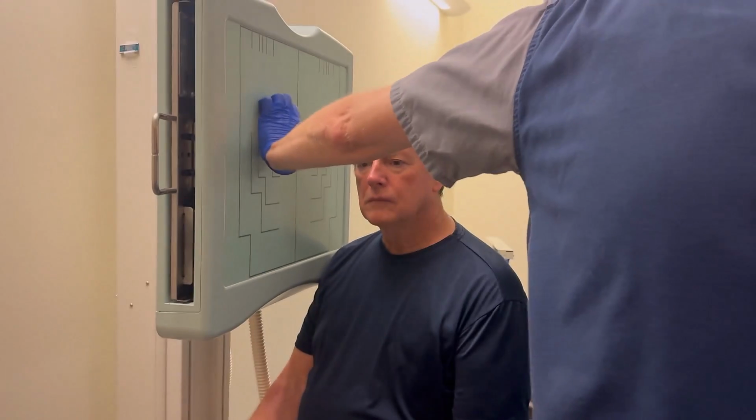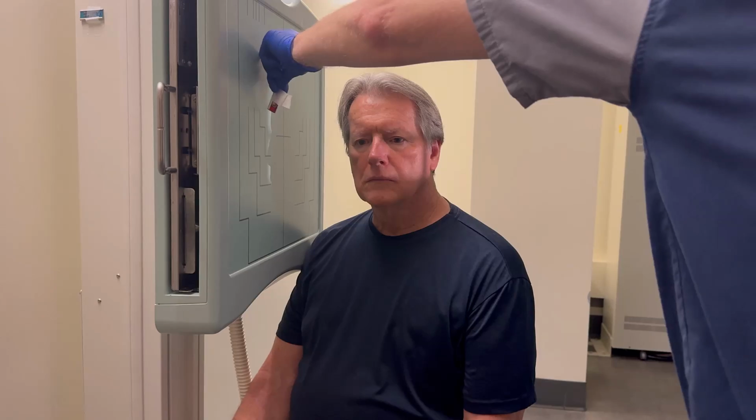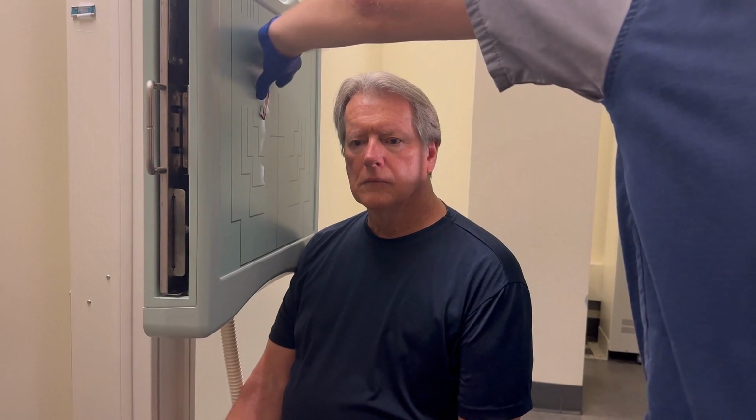Marker is in front here. Make sure it's not in the frontal bone. That outer table of the skull can be very thin there. You don't want to be putting your marker over the frontal sinus. Do a last check.